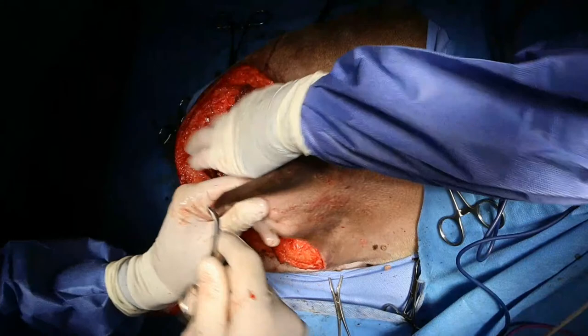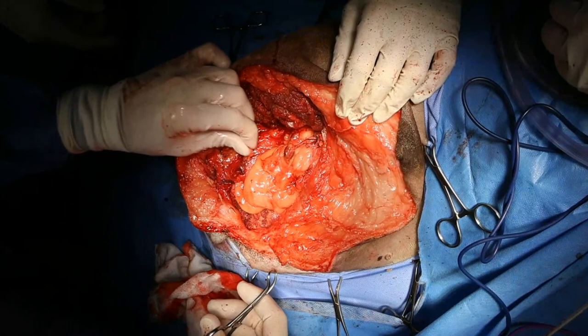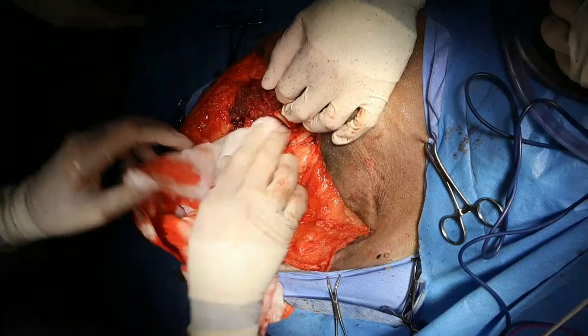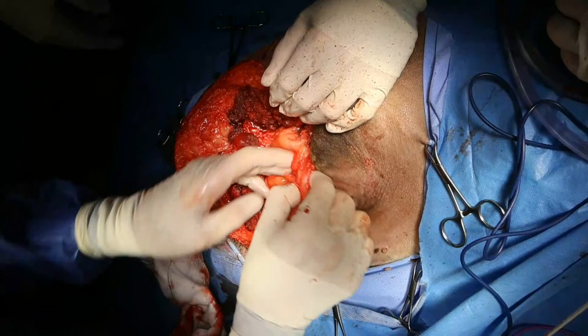We have heaps of skin here because of that procedure that we did before. So if I were to do a polypropylene mesh, what would I suture it to is the other question. And again, I have had a bladder herniate. It was a vet's dog, of course it was. A vet named Bob, I'll give you his last name. And his dog had a hemipelvectomy with me and it herniated its bladder and so we had to go back in. All right, so that's all abdominal fat here.